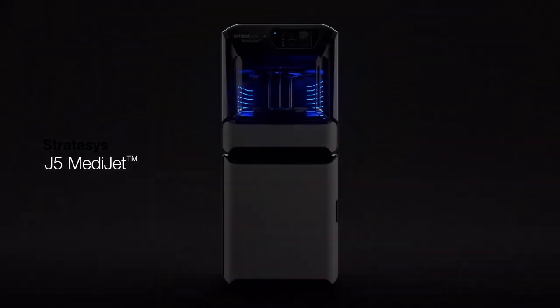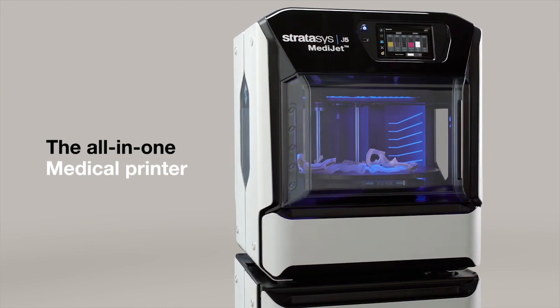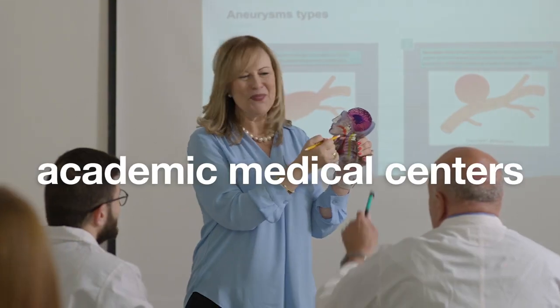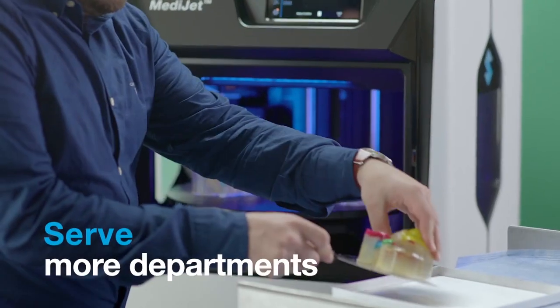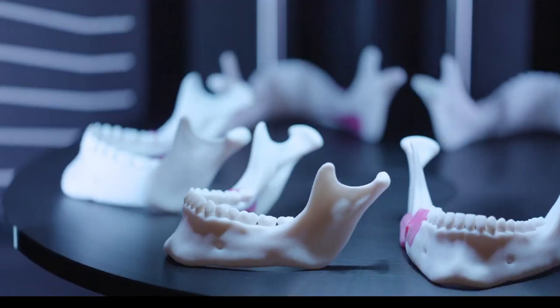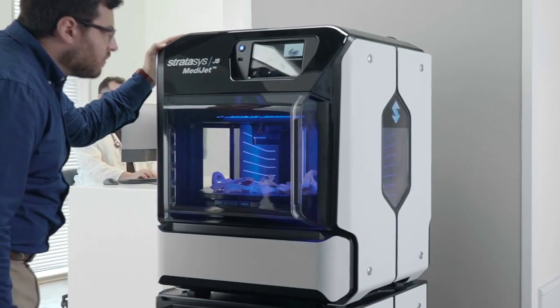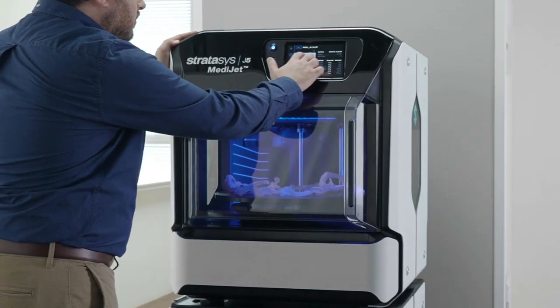Introducing the Stratasys J5 MediJet, the all-in-one medical printer certified for hospitals, academic medical centers, and medical device makers. Serve more departments with brilliantly vivid, multi-material, and multi-color medical models, all from a printer compact enough for any lab space and with a low upfront investment.